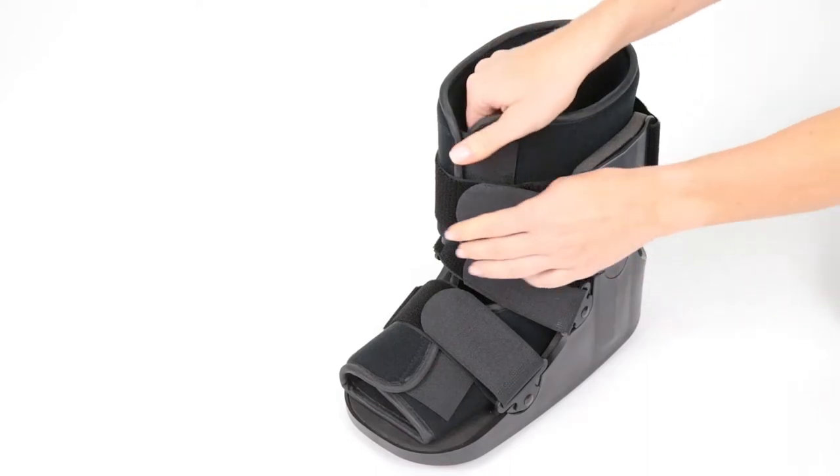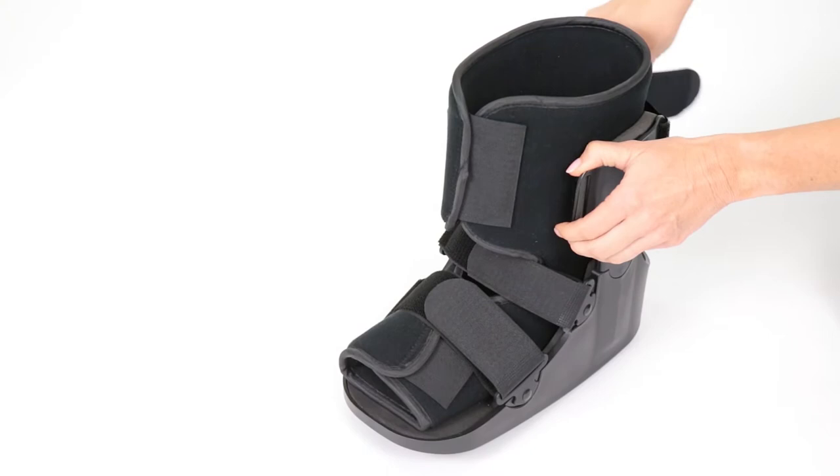Unfasten all secure straps and open the padded liner.